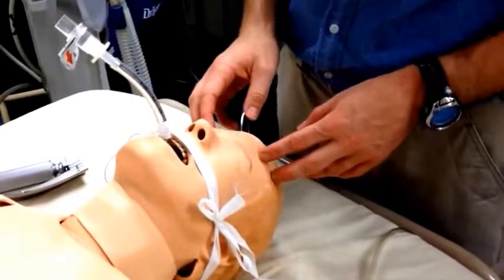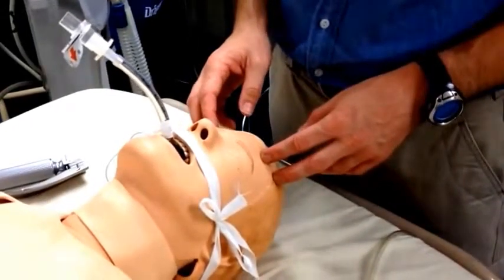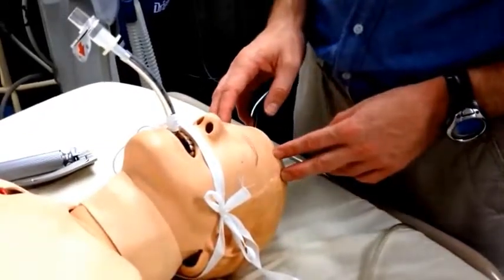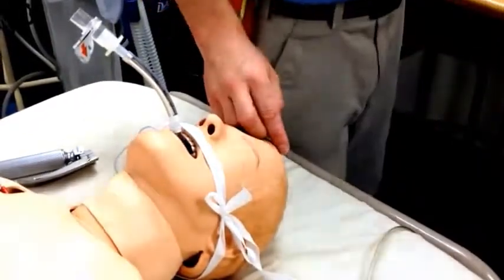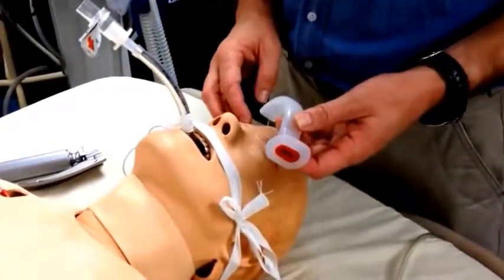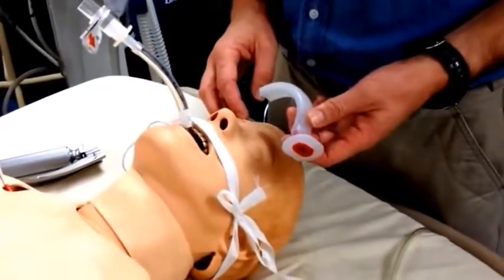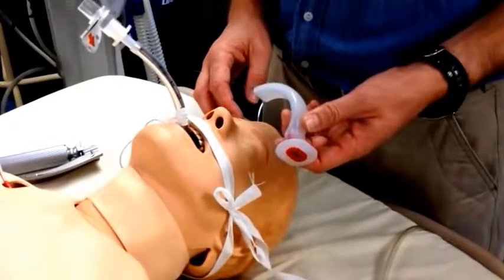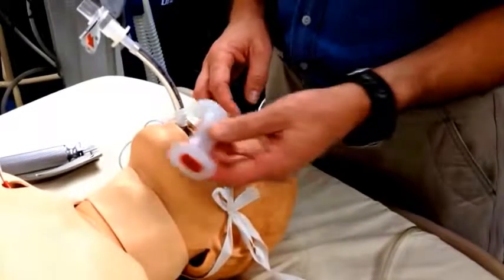A bite block or similar device is handy to prevent the patient from biting and obstructing the airway. If a specific bite block is not available to you, you could consider inserting an oropharyngeal airway. We recommend selecting one size smaller than would normally be used, as really the oropharyngeal airway is only serving as a bite block in this case.